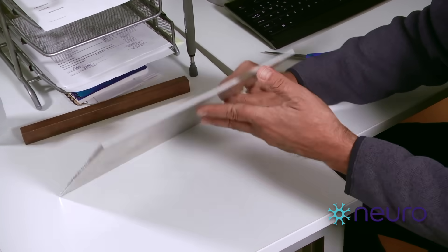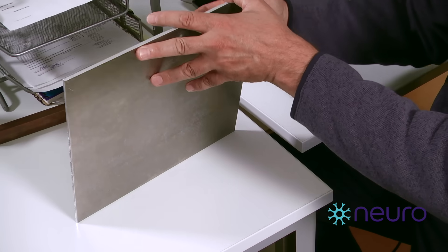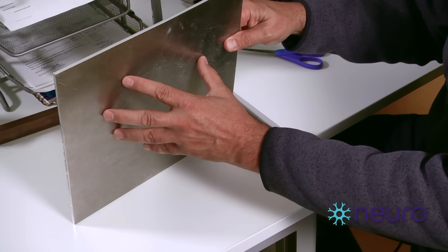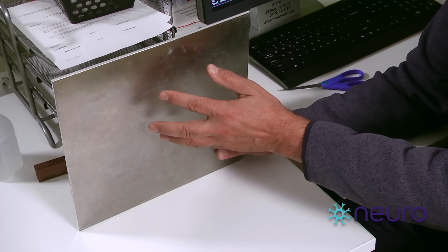What we're going to see inside the magnetic field is the plate will resist changes in its orientation, because these induce currents within the conductive material of the plate that essentially exert a magnetic force that prevents it from wanting to fall over.